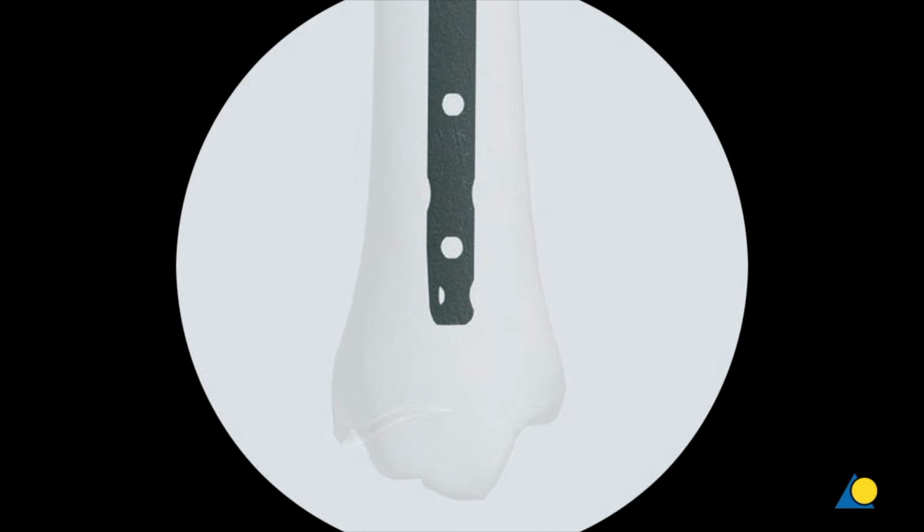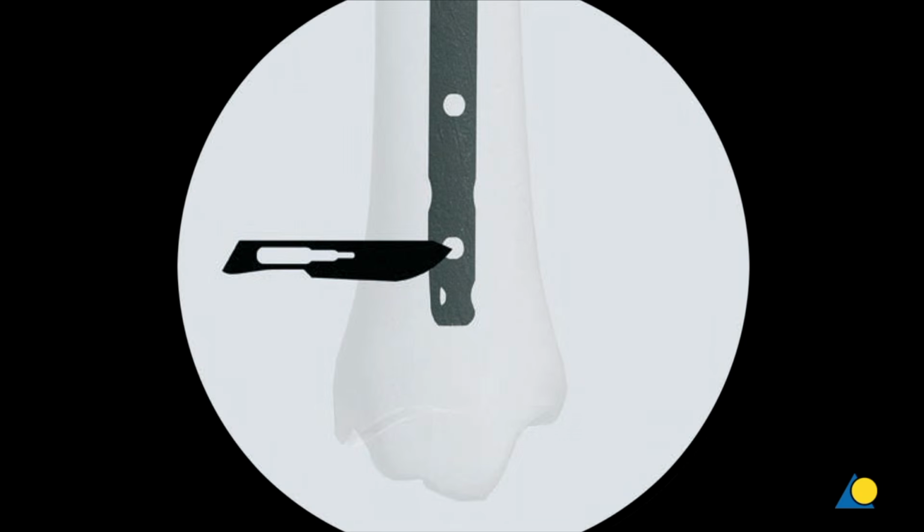The C-arm is aligned with the hole in the nail closest to the fracture until a perfect circle is visible in the center of the screen. Here, the distal mediolateral hole is used. A scalpel blade is placed on the skin over the center of the hole to mark the incision point. A stab incision is made.